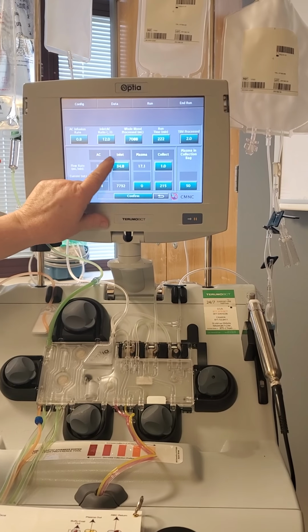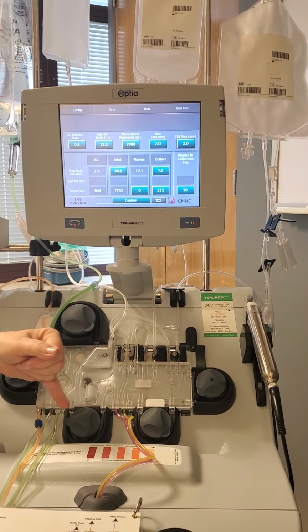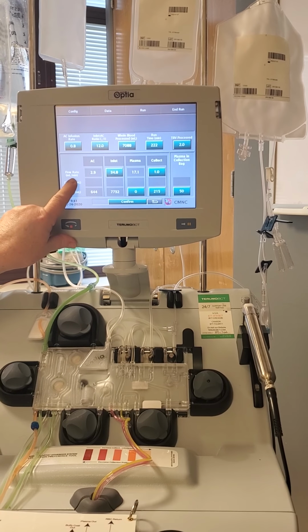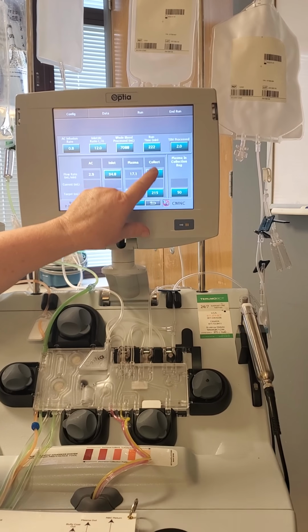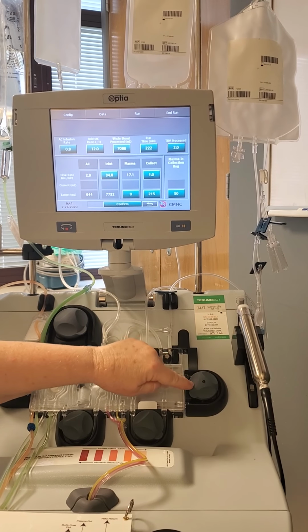Here they are. AC, inlet, plasma, collect. Four pumps. AC, inlet, plasma, collect. Each of them has a flow rate in mils per minute. See it? The collect pump flow rate always defaults to 1 mL/min. This pump right here.